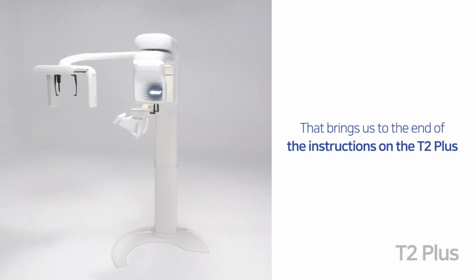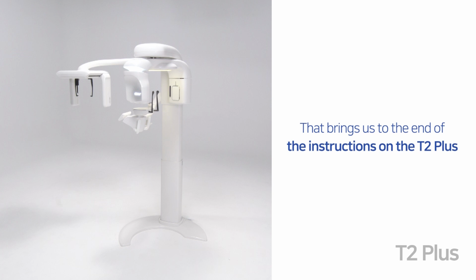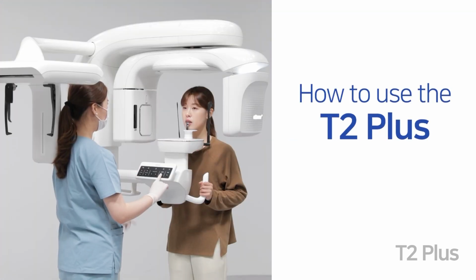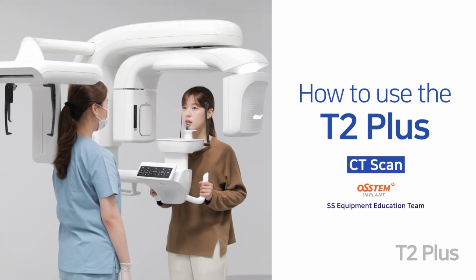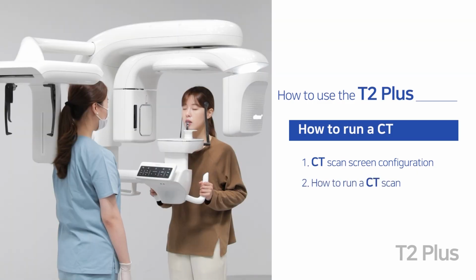That brings us to the end of the instructions on the T2 Plus. Let me walk you through how to run a CT scan using the T2 Plus. First, we'll be talking about the CT scan screen configuration, then how to run a CT scan.